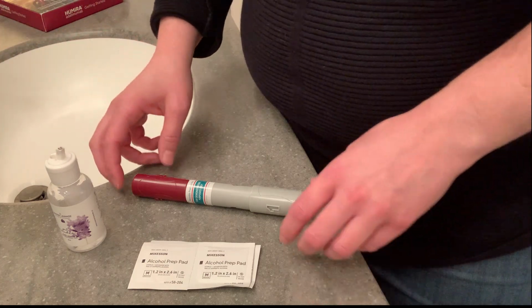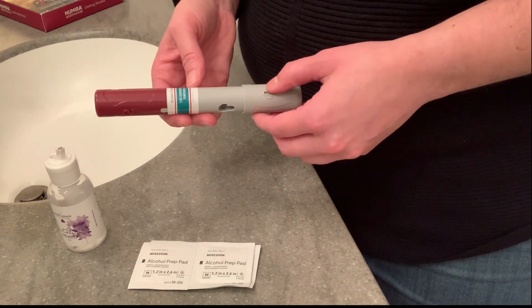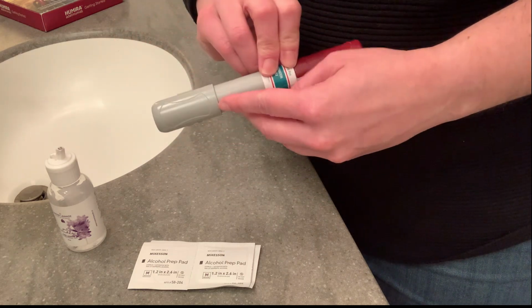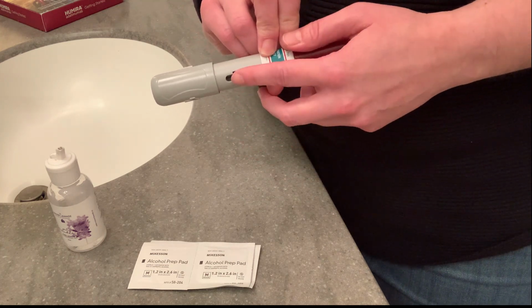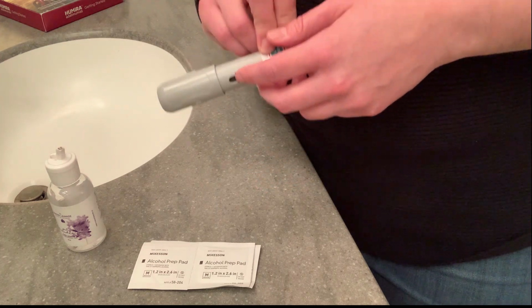So you'll start off by taking the Humira and making sure that it's not expired. You also want to make sure that the integrity is okay. So you'll find a little window on the side of the pen. It should be clear, colorless, sometimes a little bit yellow. That's totally normal. If there's a little bubble, that's also normal.